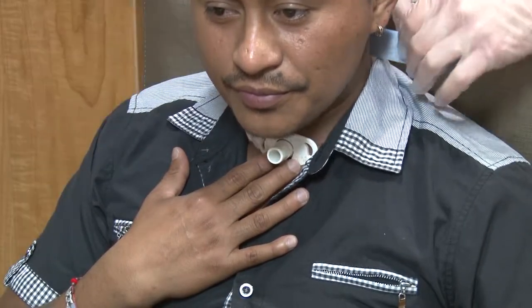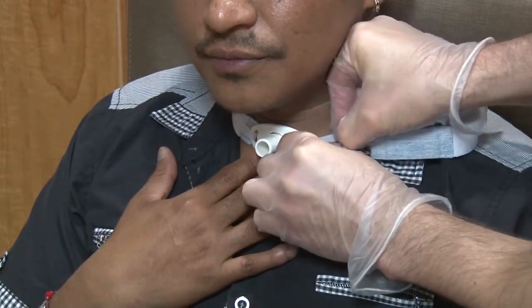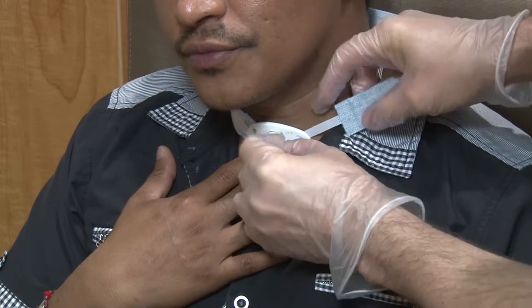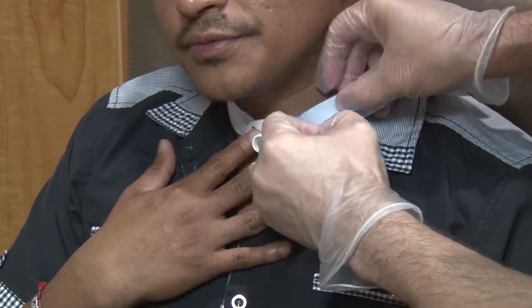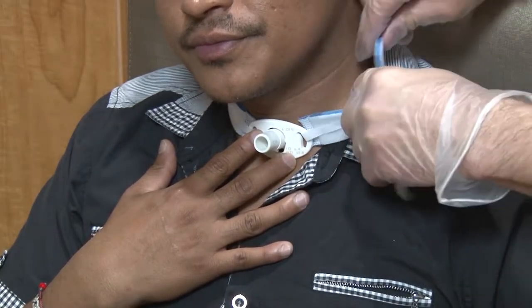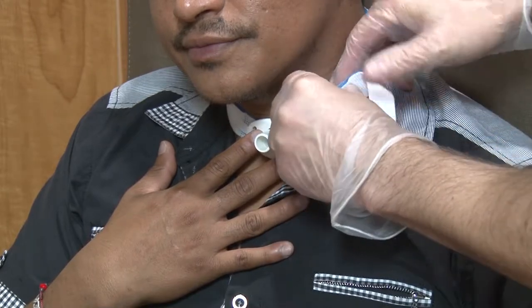Gently pull the long end of the neckband from behind your neck. Connect the two parts of the neckband together with the Velcro strip.